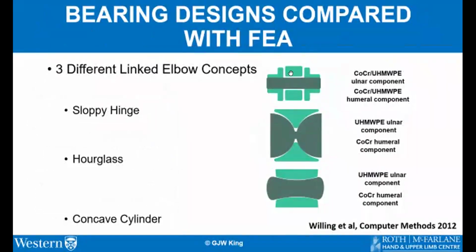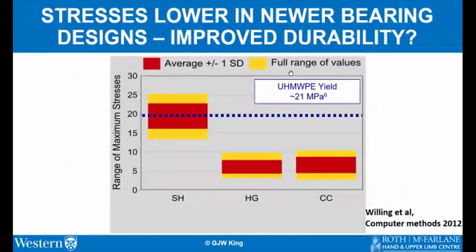Bearing designs with newer implants have been improved. We compared 3 different designs here: a sloppy hinge, hourglass, and a concave cylinder in a finite element model. One can see here that the stressors were lower in the newer bearing designs, and hopefully this will lead to improved durability.